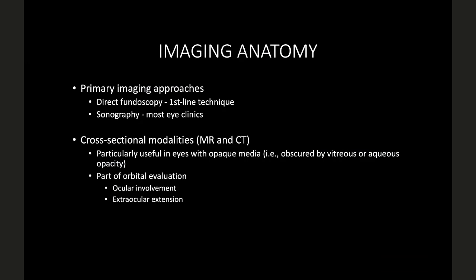But when you guys are looking for, say, orbital pathology, I'm looking for something unique, then you go for an MR. Generally speaking, for orbits, a lot of times CT takes care of the problem. One, it's quicker, it's cheaper, and if you're looking for anything soft tissue like an abscess or whatever, go in for CT orbits with contrast. If you're looking for trauma or anything, go for CT orbit without contrast. There is no need to do both with and without. Can it be useful? Yeah, but the risk of it is increased radiation, which we do not want, okay? So go in for it.